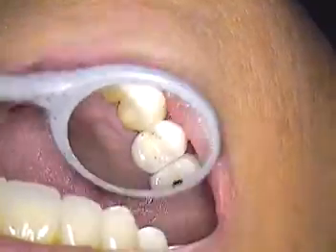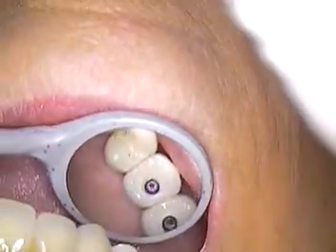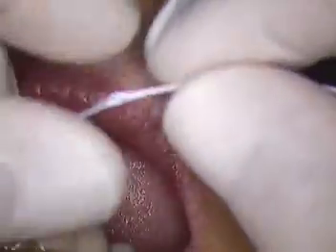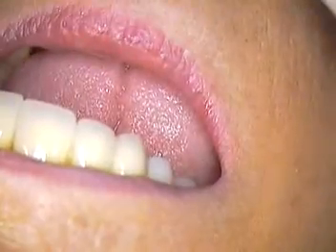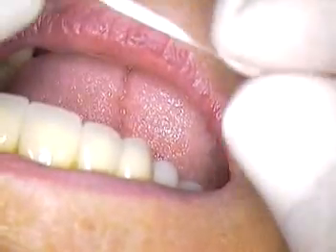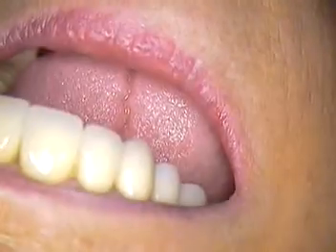Let me just show you how thin a piece we have. It's got that nylon material, so it's not going to really shred — if it does, it'll break. What I do is I just underhand tighten on both, and I wait five minutes for the tissue to displace, because you can get a false reading from your driver and your threads. So you want to make sure of that — I walk away five minutes, come back, and then hand-tighten the rest of the way.